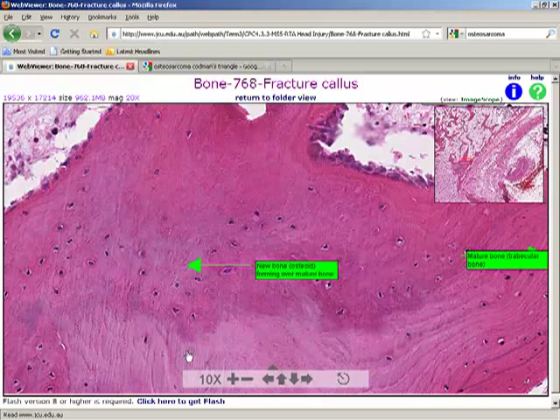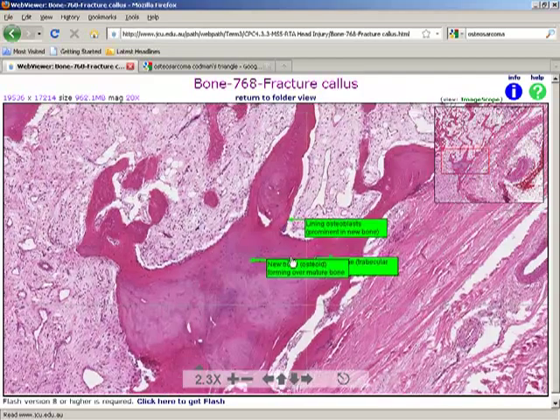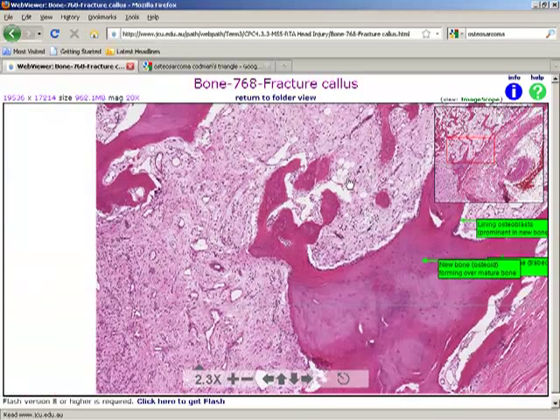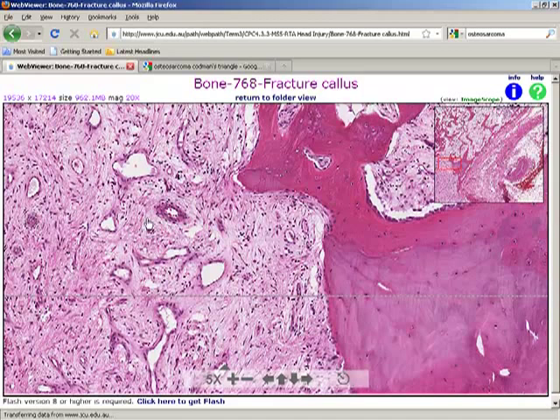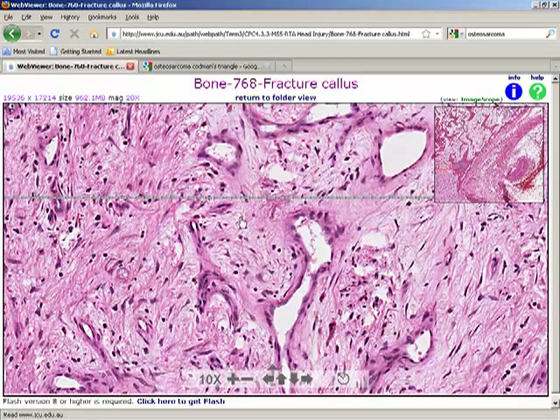Okay. So this is some biopsy from the edge of the fracture. You can see the new bone being formed over the mature bone, and the marrow tissue that is surrounding the fractured bone is all blood vessels and fibroblasts. Plenty of blood vessels and inflammatory cells, RBCs. This is the granulation tissue, the healing tissue.